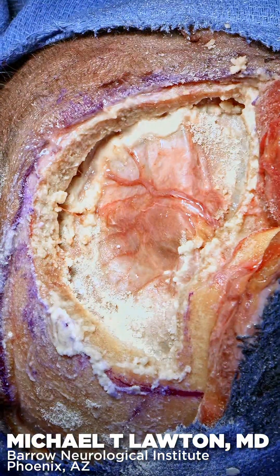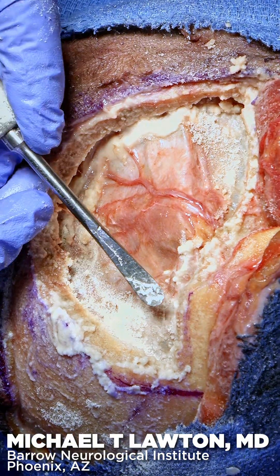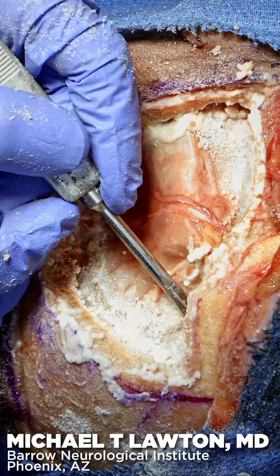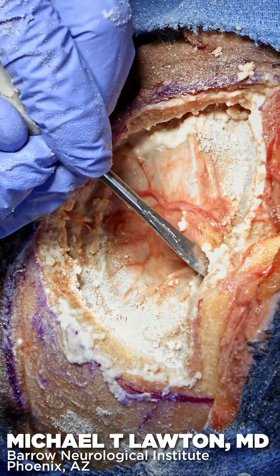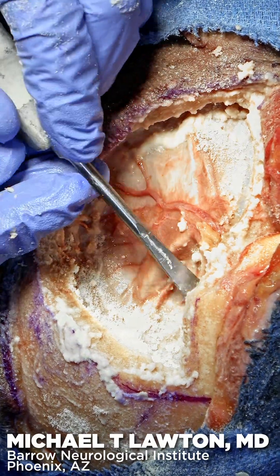We've got a very sagging brain, so elevating the dura is not going to be a problem. You can see how the dura strips from that inner surface here. There's the orbital roof — there it goes.